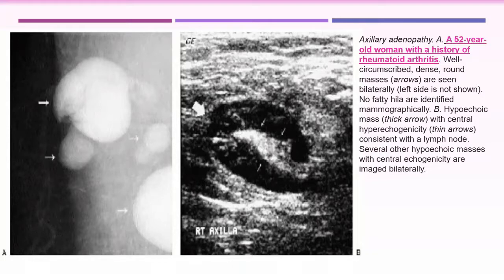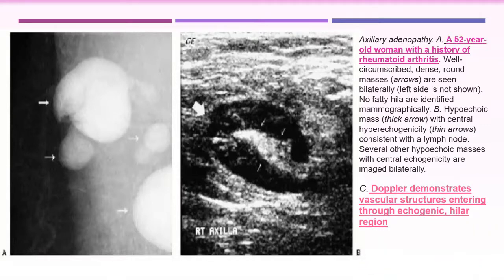The cortex, whether it is smooth and regular, increased thickness or just asymmetric. And we can see the outlines of the cortex, whether there is a breakthrough in the capsule or not, and the edema. And on Doppler here it is not shown. Also, you can differentiate.